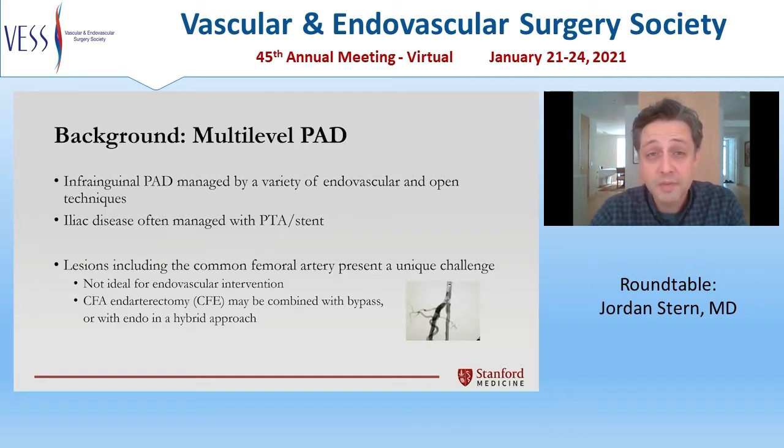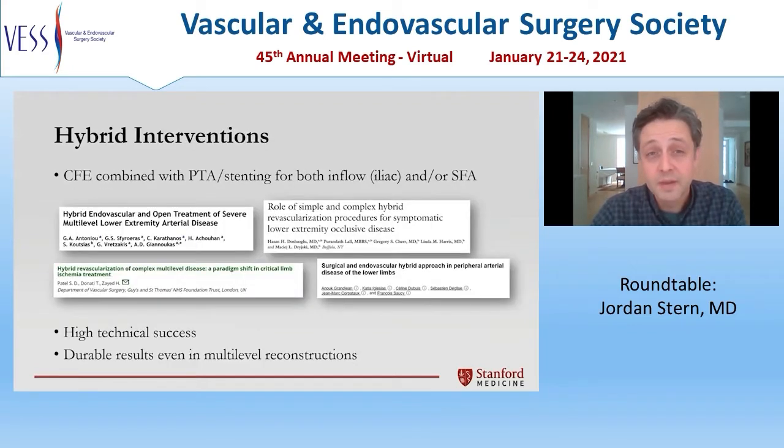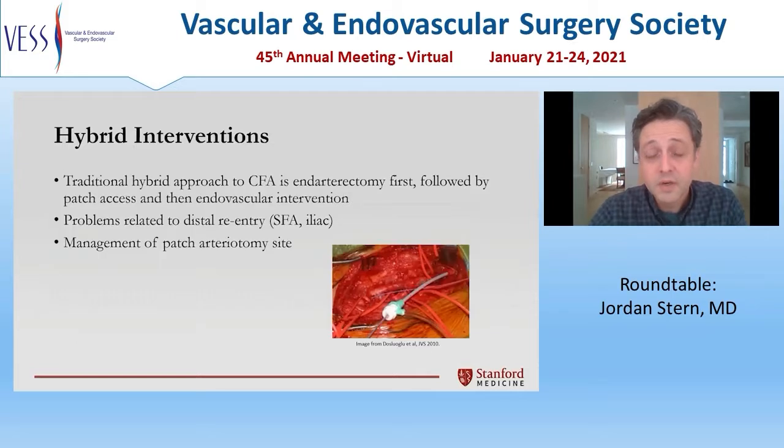The common femoral is most commonly dealt with using an open endarterectomy technique, and this may be combined with either bypass or endovascular approaches to address multi-level disease involving the common femoral segment. Hybrid interventions involving the common femoral have been described a number of times, and over time have demonstrated both high technical success as well as durable results, even in multi-level reconstructions. The traditional approach involves an open approach to endarterectomy of the common femoral first, followed then by patch access and endovascular interventions either in the SFA or the iliac inflow disease.